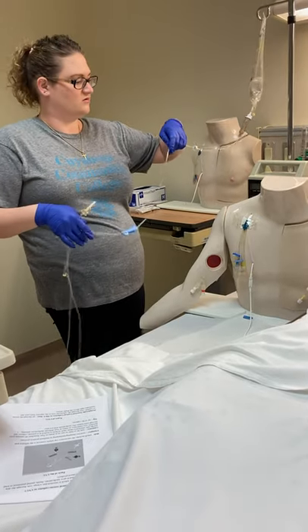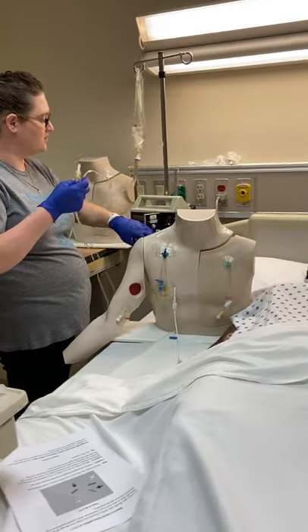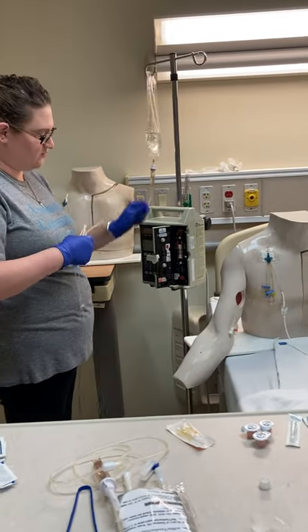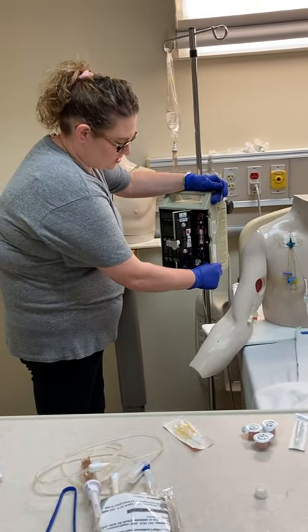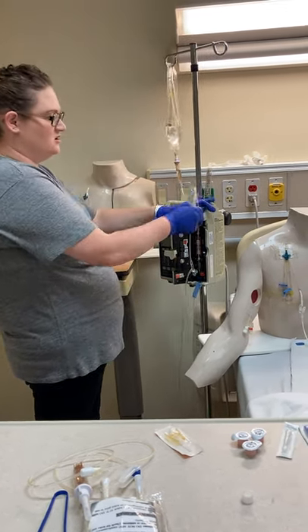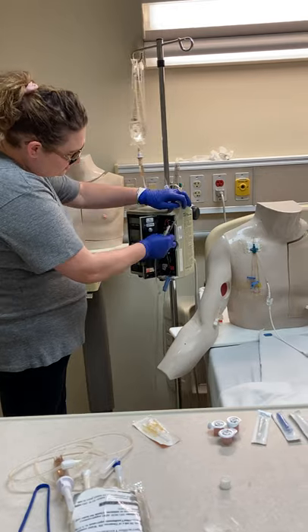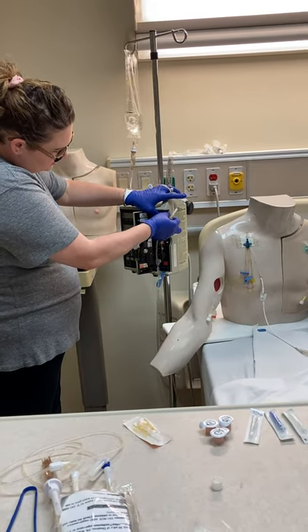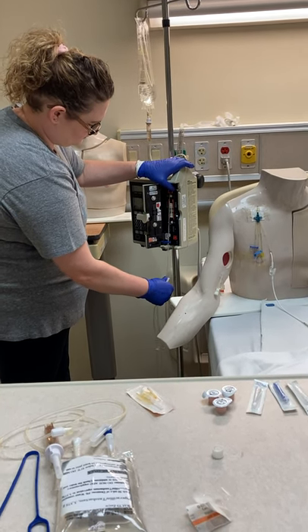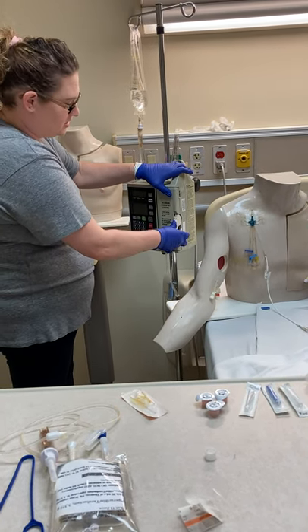That's all primed through. We have our order — this time they want us to do 75 mLs per hour of saline. Just like we did last time, we open our hatch, make sure the orange clamp is all the way flat against the machine, making sure our piggyback port is above the pump, and we've threaded it through.